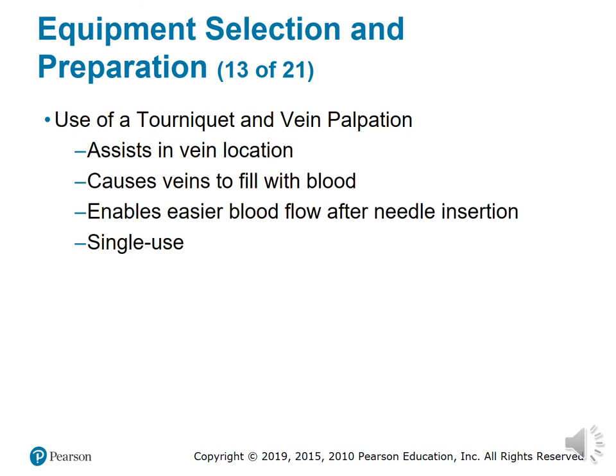Use of a tourniquet and vein palpation assist in vein location, cause veins to fill with blood, enable easier blood flow after needle insertion, and they should be single use.